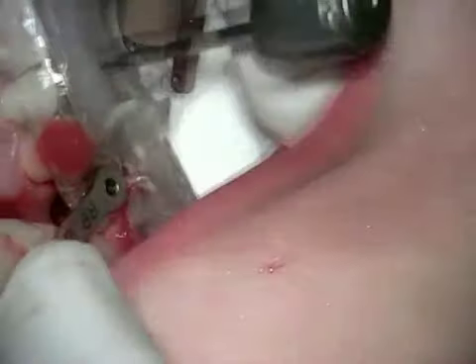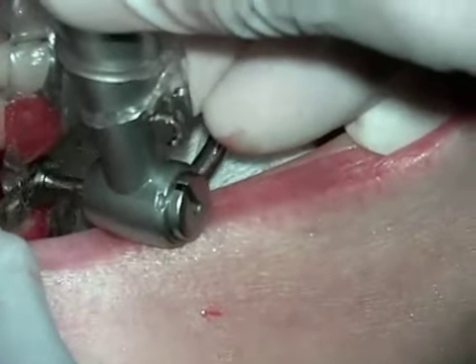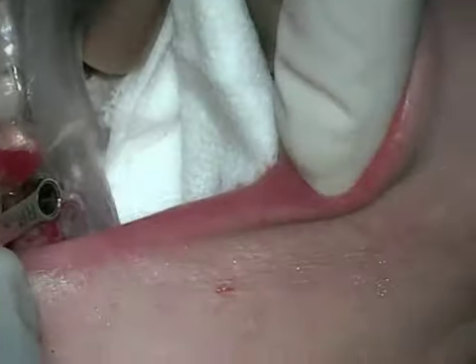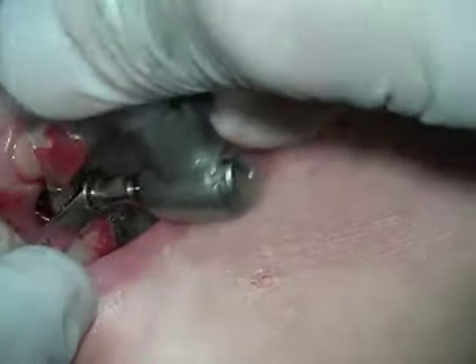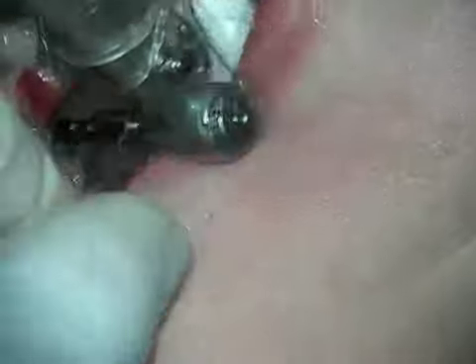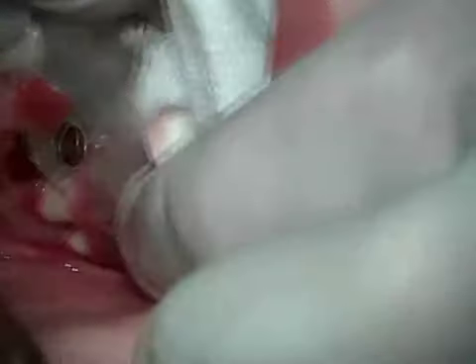So first we start with the 2.0 twist drill. You don't need to use the tissue punch because obviously there's no tissue there because the tooth was there. And we're going to drill this to 13 millimeters with, again, lots of irrigation. We're then going to go to the narrow platform or narrow diameter drill, 13 millimeters in length. I'm going to skip the 8 millimeter length because basically this is an extraction socket, and so 8 millimeter isn't even going to hit the walls. So I'm using here the little guide sleeve that is going to allow the narrow platform drill to be used with a high degree of accuracy in the regular platform drilling sleeve.